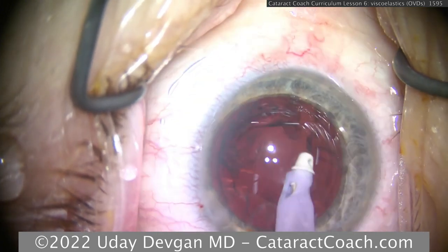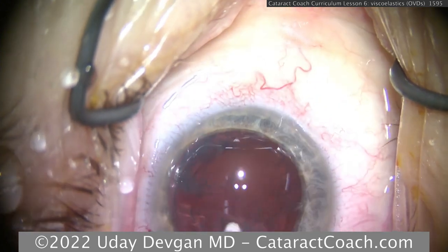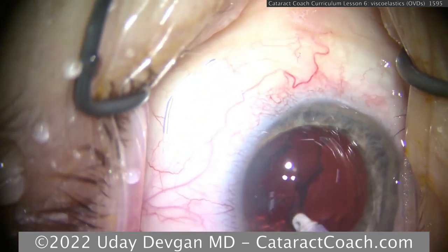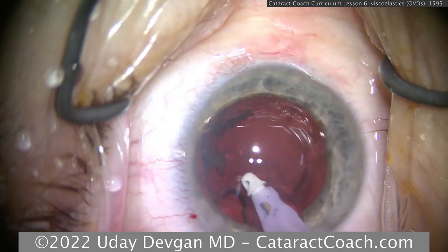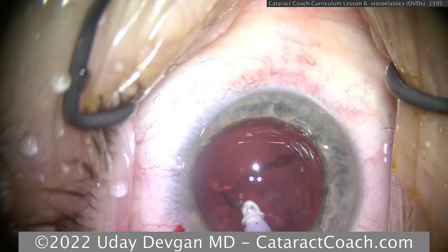So taking out the lens cortex, 360 degrees. Again, I like the circumferential manner to grab at least a couple clock hours prior to stripping it towards the center.